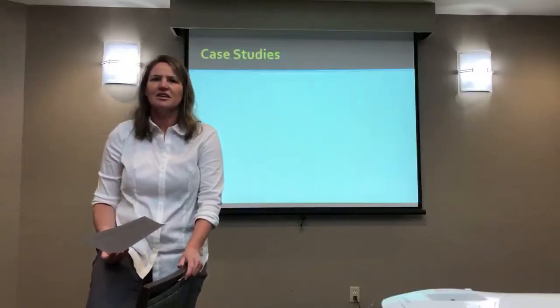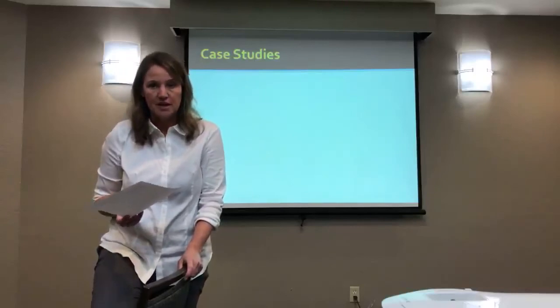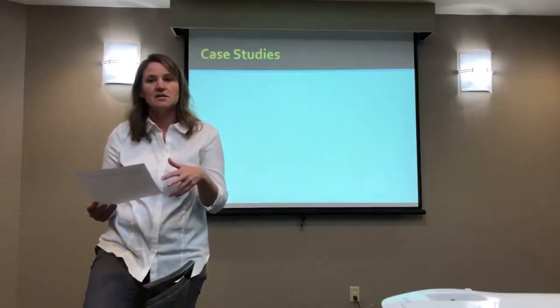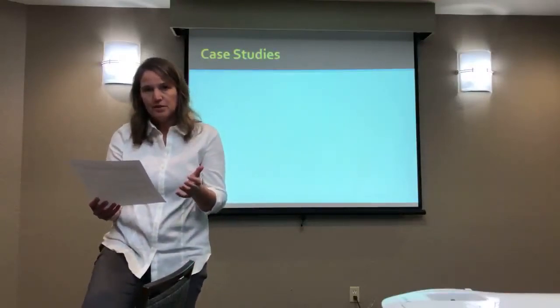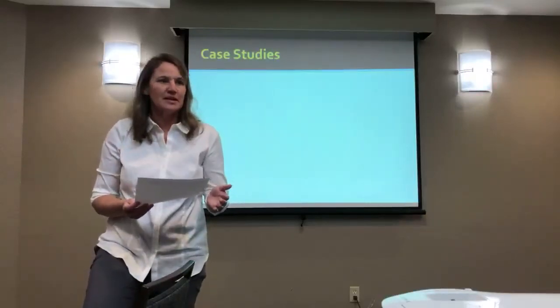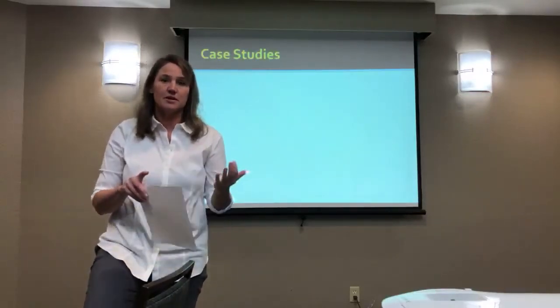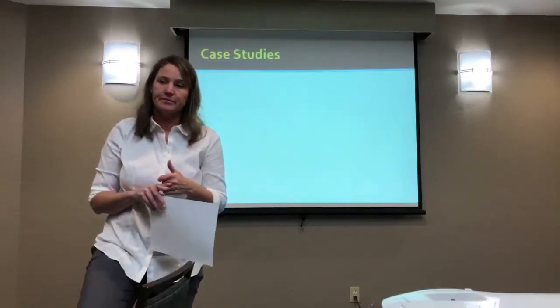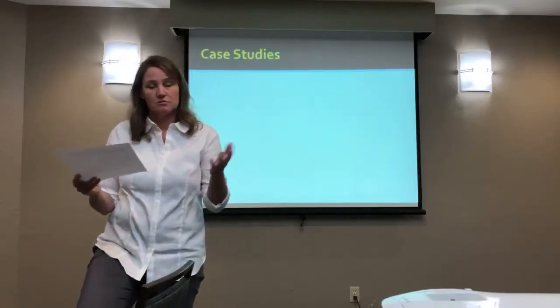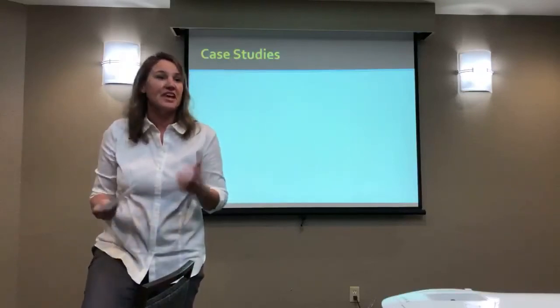What do you think of that? Non-thermal. Okay, so you're thinking non-thermal for healing of tissue. Yes. So back to the same idea with the other ones, you assess the patient. Because even an acute problem, you're gonna question why did this happen? Is it truly just because you overused it that one day? Or do you have potential problems that could become chronic down the road? I mean, they've obviously been playing tennis, so that would be a question I would ask. Was this a once every 5 years thing that you did for a fundraiser?